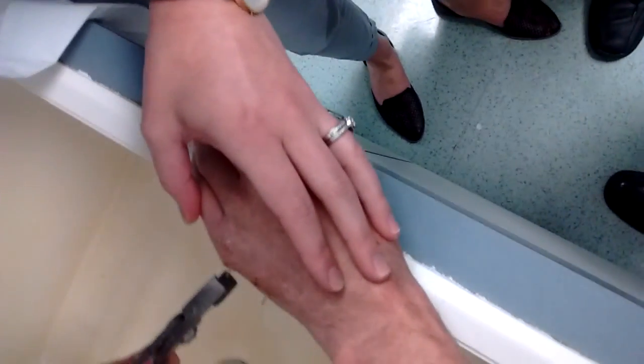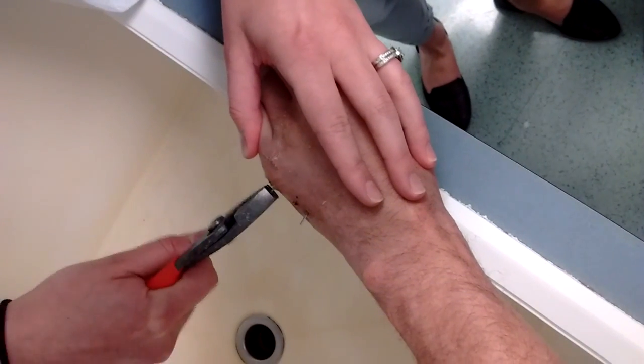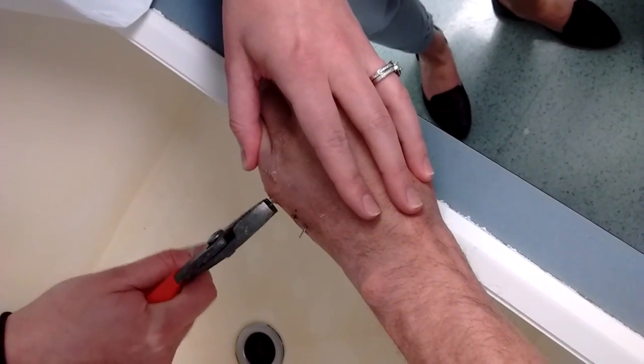Looking for some dramatic stuff. It will bleed — it's just got some blood coming out. And it will slowly come out.